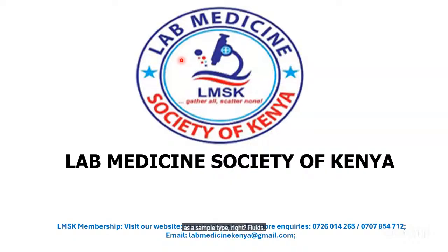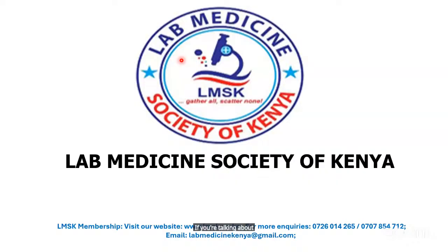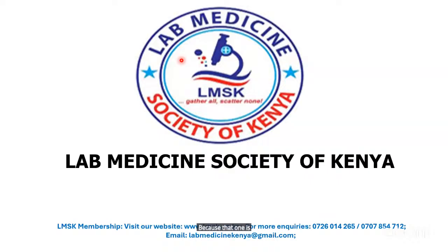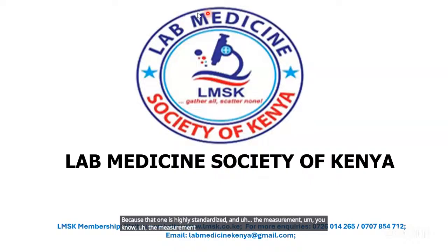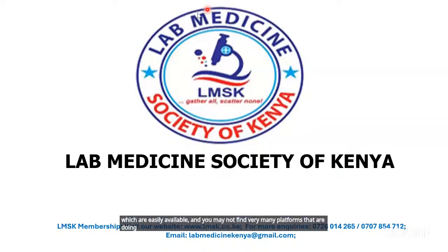Fluids have troubles with reference values. If you're talking about urine as a fluid, or other fluids, there is trouble with the reference values. But the best sample for you to use is serum, because that one is highly standardized, and the measurement modalities exist for it, which are easily available. And you may not find very many platforms that are doing urine analysis for these particular analytes.